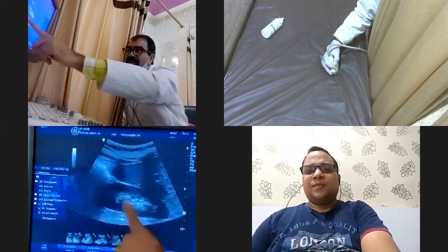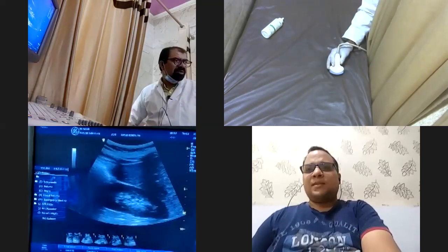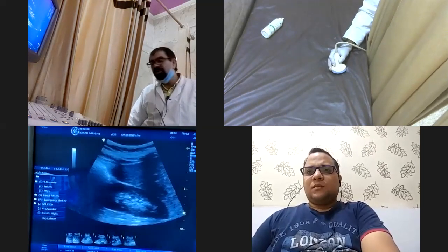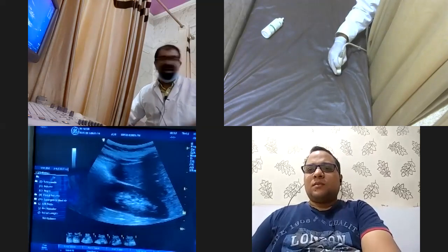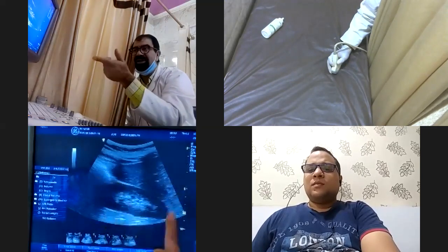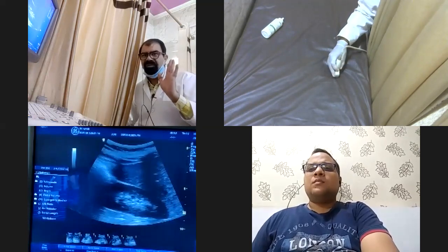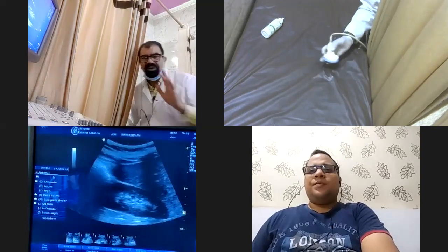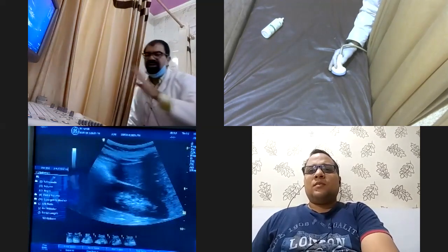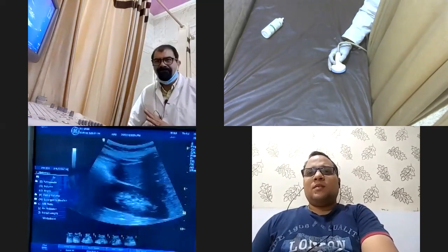Anterior and posterior will be the same. Clear? Now, the moral of the story is that even if you rotate anti-clockwise, and you know the screen orientation will be reversed, inverted, you can rotate it anti-clockwise also. Clear? So we are done with the transverse, anterior, posterior, superior, inferior, and the clockwise and anti-clockwise rotation. Clear? Any question till now? No, sir.